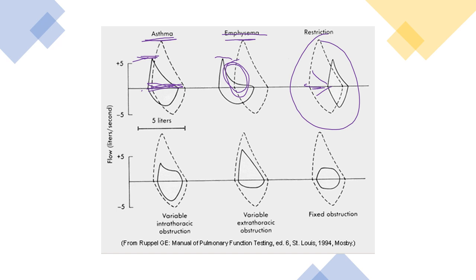You'll see the fixed airway obstruction typically on inspiratory, which would be this part down here, and then expiratory up here. Usually you'll see the fixed look with people with an artificial airway, so tracheostomy or ET tube patients on a ventilator. That's that typical flow volume loop you'll see. Variable extrathoracic and intrathoracic: if someone has vocal cord dysfunction, you could easily see that on the inspiratory side of their flow rates, right? Because they're having trouble getting gas into the lungs because their vocal cords are obstructing the flow. Extrathoracic, right? So hopefully you see this pattern of these flow volume loops.